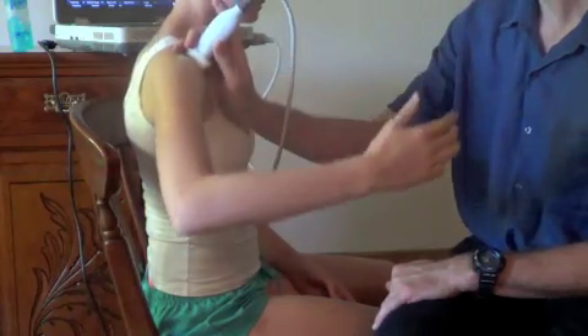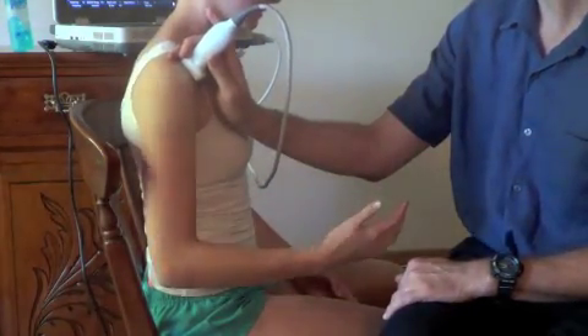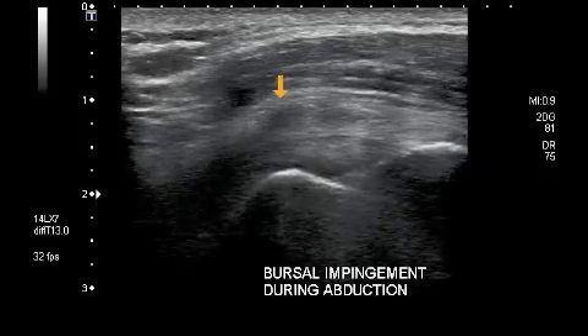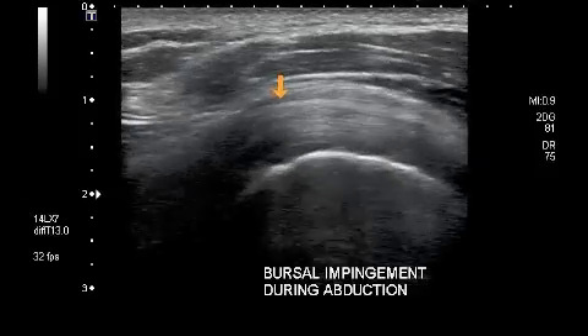Next, assess the supraspinatus tendon and bursa during shoulder abduction. If there is dragging or buckling of the bursa, then the bursa is becoming impinged. Ask the patient as to whether this brings on the pain they normally experience.